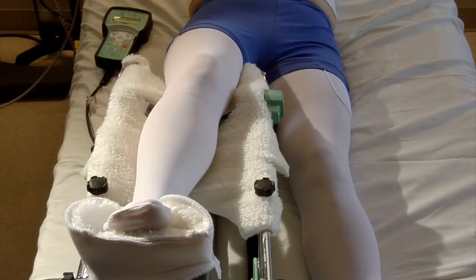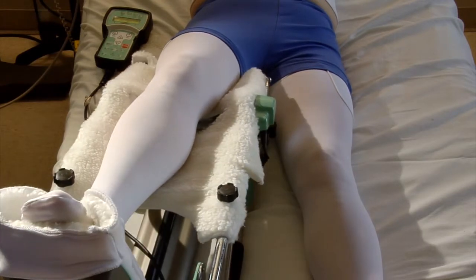Many clinicians will want to place the CPM in a position that makes it parallel with the sides of the bed or perpendicular to the footboard of the bed. While this seems logical and may work for some patients, we find they are much more comfortable if you abduct the affected leg and CPM.